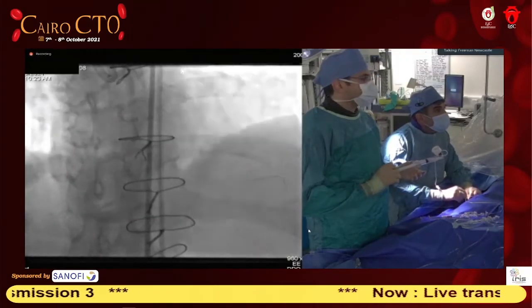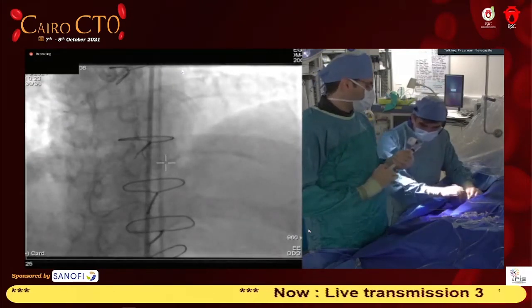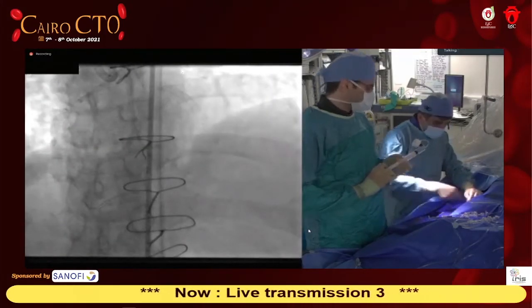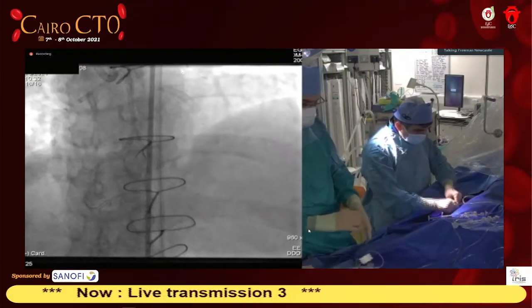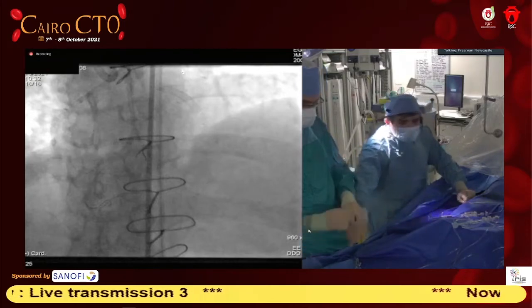That does not bode well. Okay, that's fine. Oops, did I pull the wire? I think a guideliner would help here. Okay, that's all right. My hands are sticky. Yes, this is having 2 hours. Okay, it's all right. Here we go.